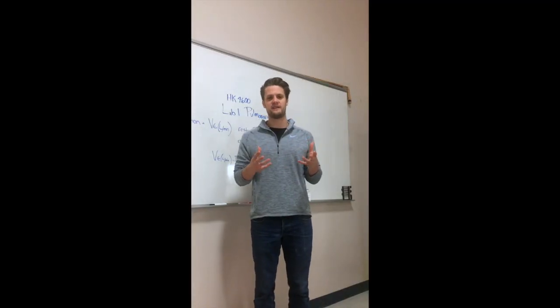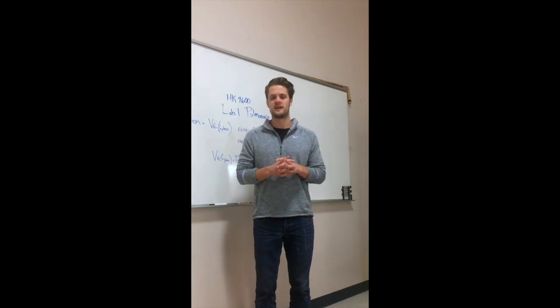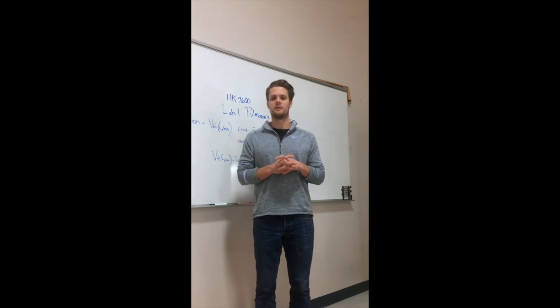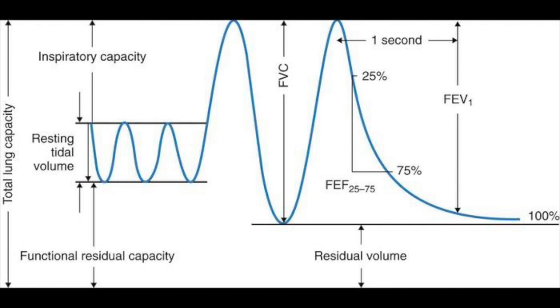Moving on to how we test these, the most common method of measuring lung function is through spirometry. Spirometry is the measurement of the movement of gas into or out of the lungs during various breathing maneuvers. We can do this using a spirometer, which captures air being breathed out. So today, with our spirometers, your group will be testing static lung volumes and dynamic lung volumes. The static lung volumes are not affected by the rate of air movement in and out of the lungs. It's important to remember, while dynamic lung volumes are, however, affected by the air flow out of the lungs.